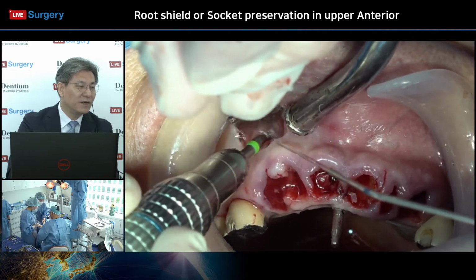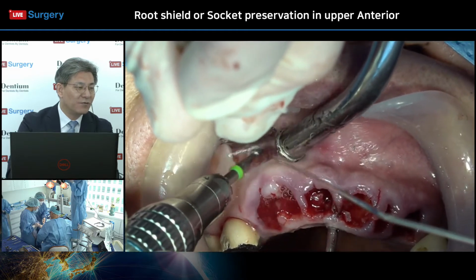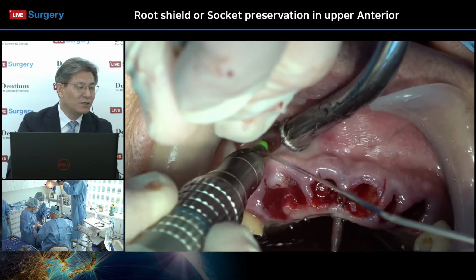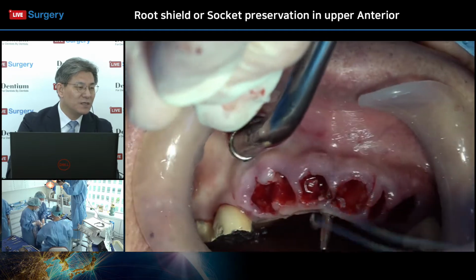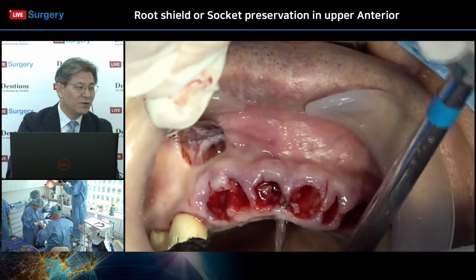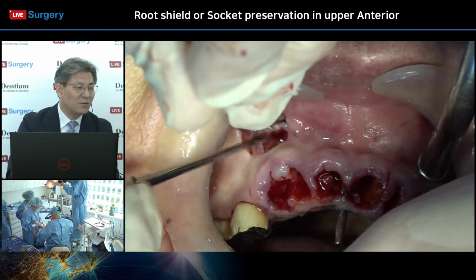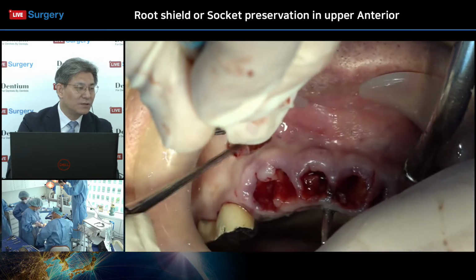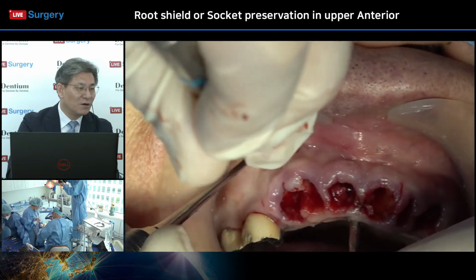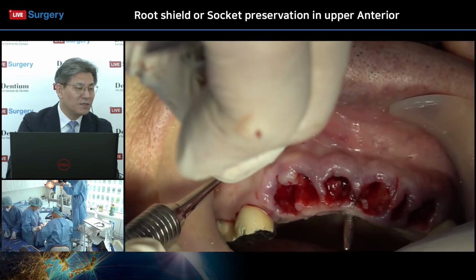A very big defect, as you know. These areas, as I already mentioned before, when we look at the CBCT before starting the surgery, in the previous PPT I explained about the apical portion of the lesion, the apex of the canine area, with CBCT.